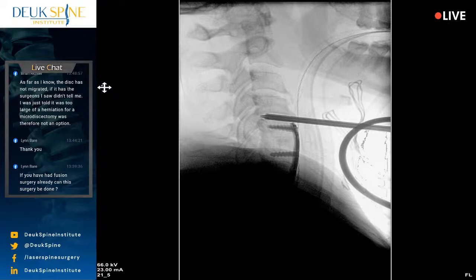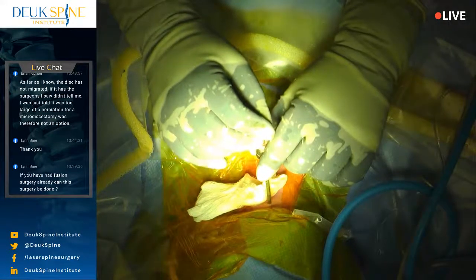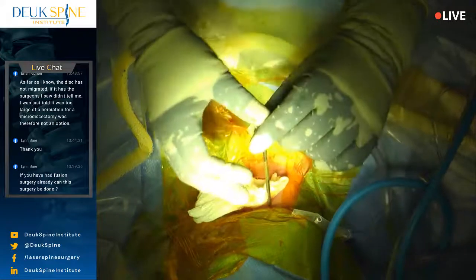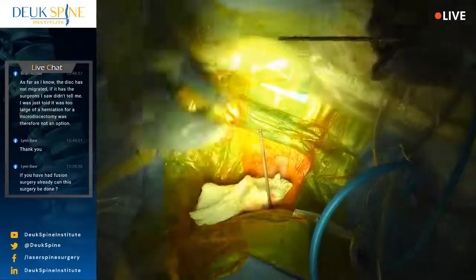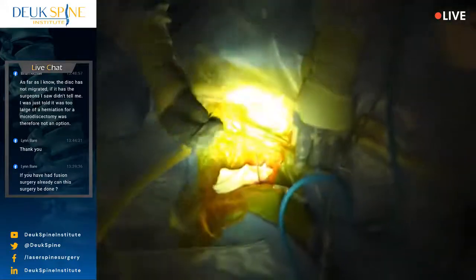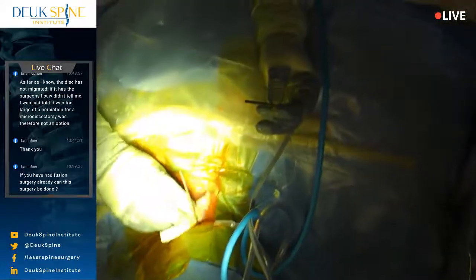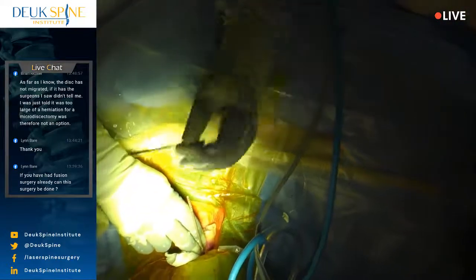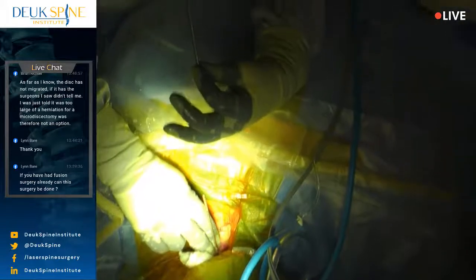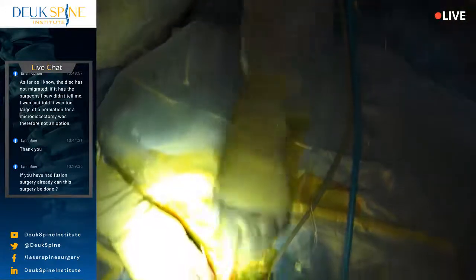The next one up is not as bad of a herniation, but we're going to go up and repair it because I think it's causing pain. So I'm going to leave my dilator. Shot. Dilator stays in the disc. Tube comes out. We did the whole surgery through this tube, by the way, in case you didn't know. Take a look right here. You guys see this tube? Looks like a little coffee straw. That whole surgery was done through this tube. Anyone got a mochaccino? Just kidding.